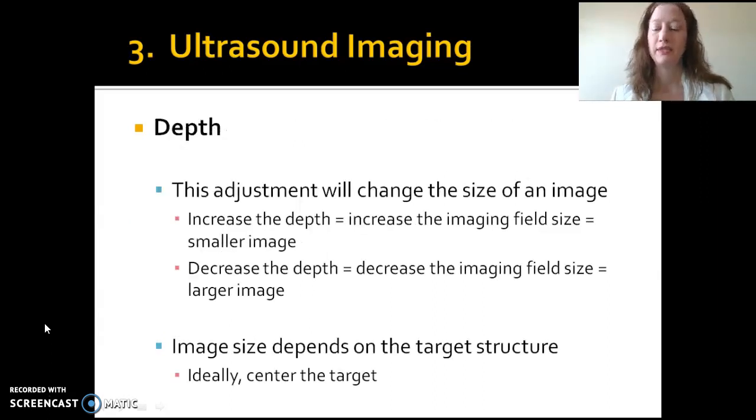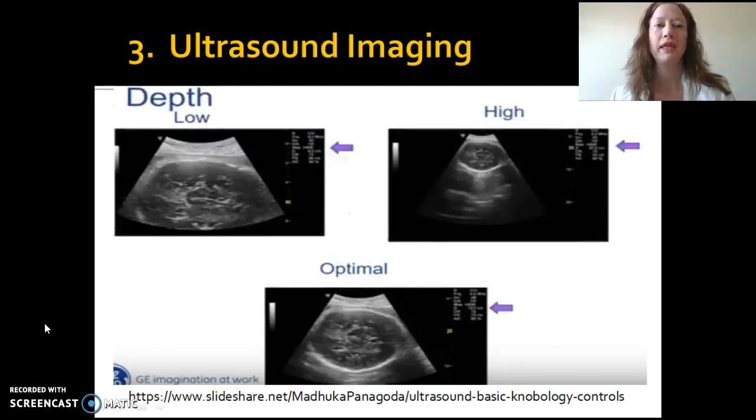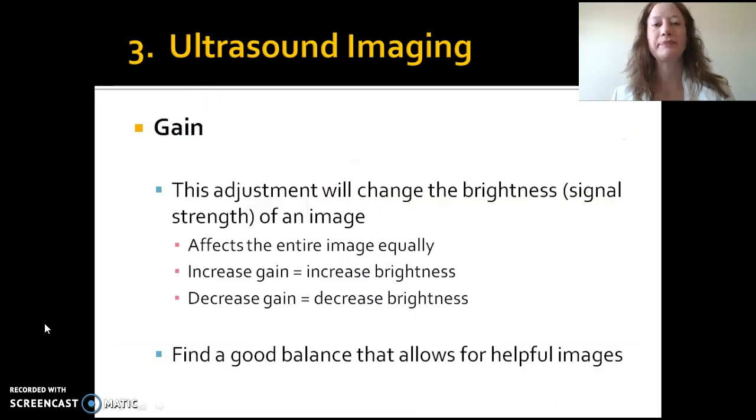One of those adjustments is called depth. It basically changes the size of the image on the screen. When you increase the depth, it actually makes the image smaller, and vice versa. And this can be a bit confusing. Basically, you want to center the image. And here's a really great picture of too little, too much, and just right depth as an example.